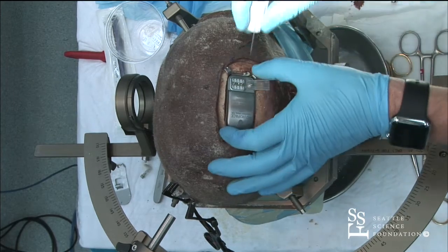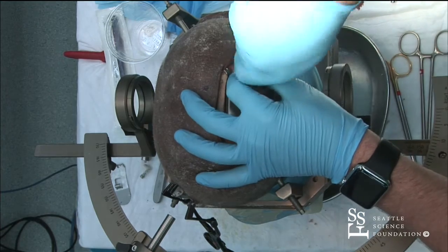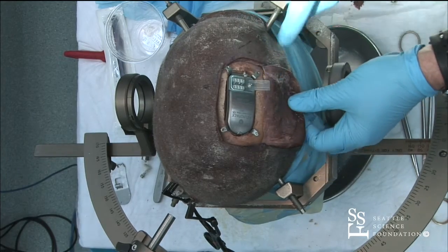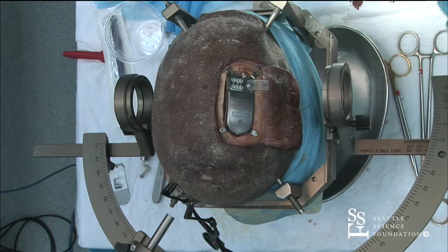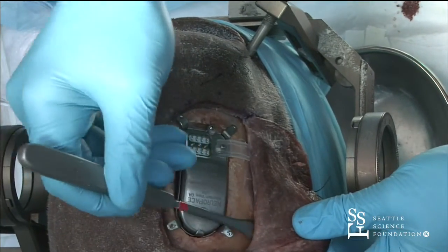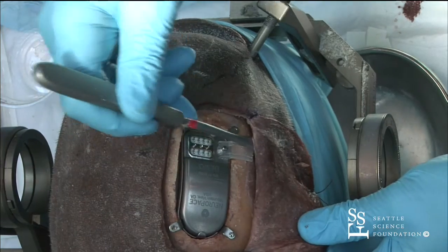So key also is to make sure after you've put it in, you have to tighten down the torque wrench. Otherwise, this thing is not locked into place. And then you can see here that this is where the electrodes are going to come off. And so typically, I will try to undermine the skin, the galea here, and make a nice pocket down here so we can fit any extra electrode underneath this flap.